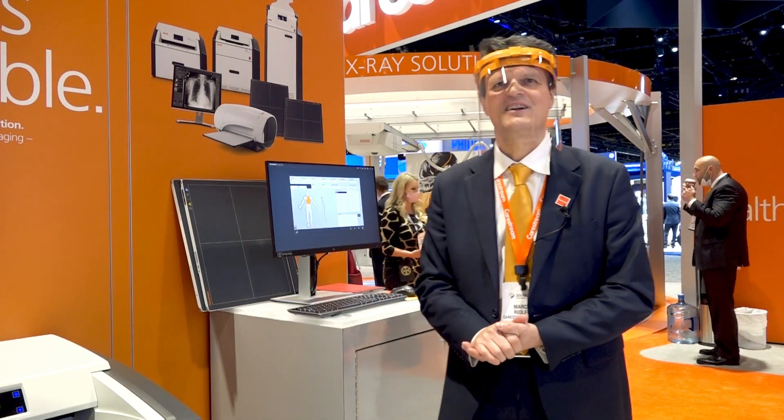Hi to all of you from RSNA 2021 in Chicago. My name is Mark Oriolfo and I'm the marketing manager for Value Tier solution.